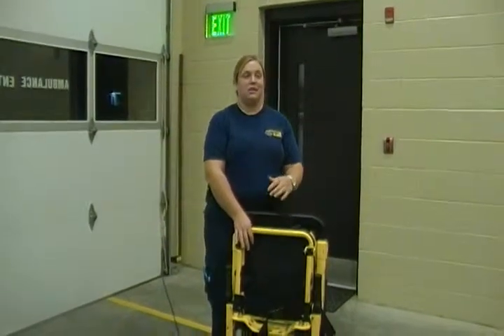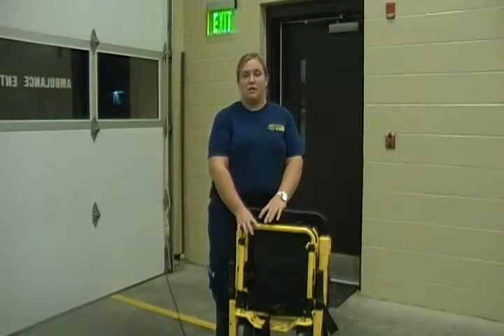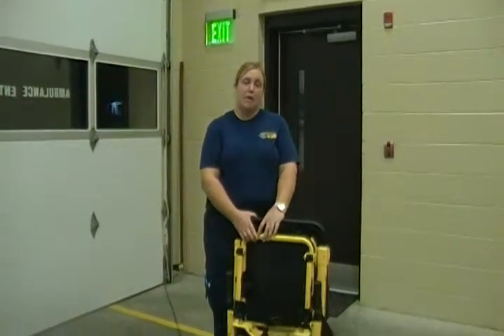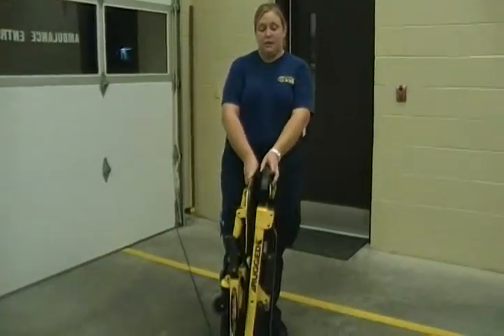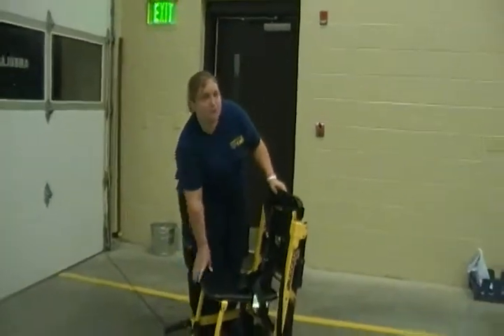Today we're going to learn about the Stryker Stair Chair and the Stryker Stretcher. First, we're going to go with the Stair Chair. The Stair Chair can be found in the side compartment of the ambulance. It will be folded up in the ambulance like this. Whenever you pull it out, you want to fold it out to a seated position.